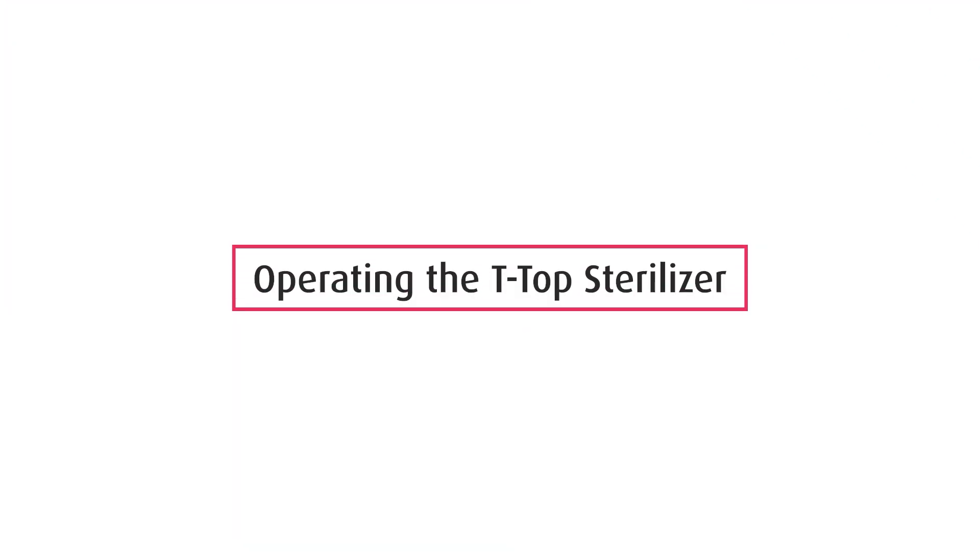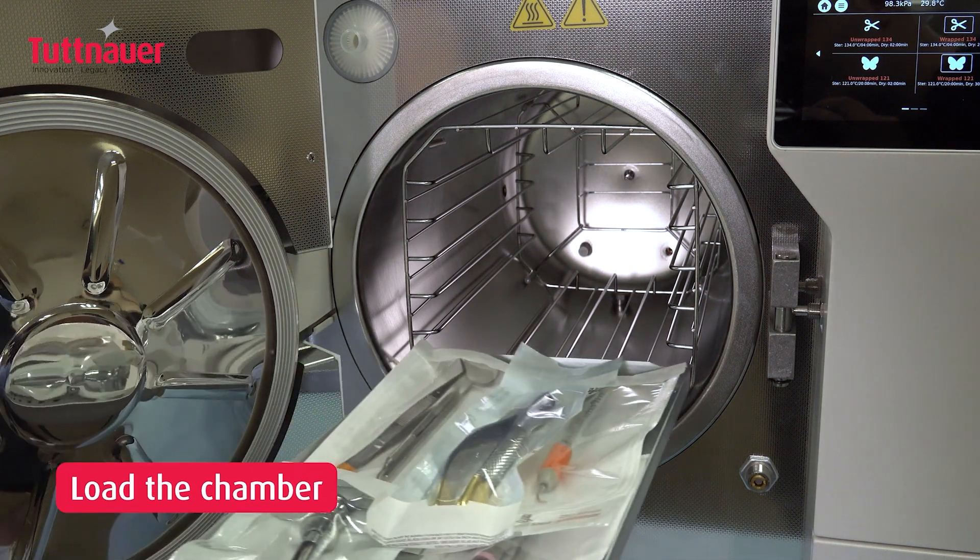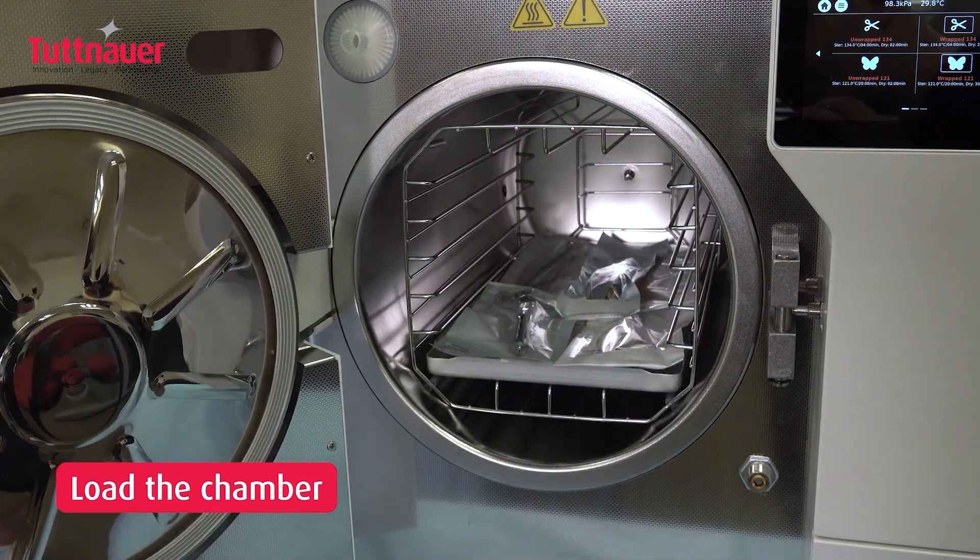This video enhances your understanding of running a sterilization cycle. Start by placing instruments inside the chamber using trays or cassettes of your choice.